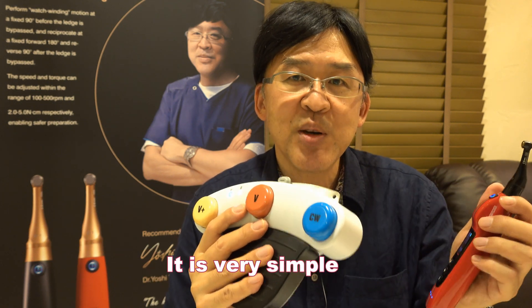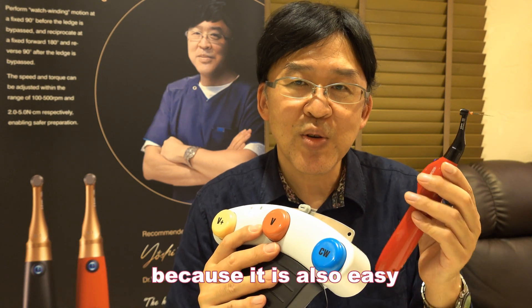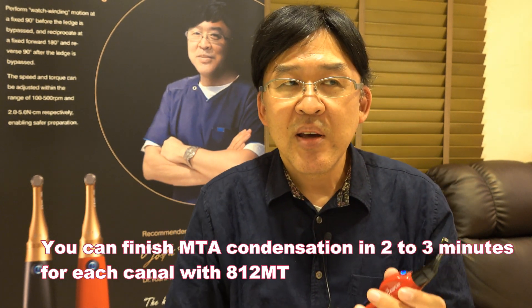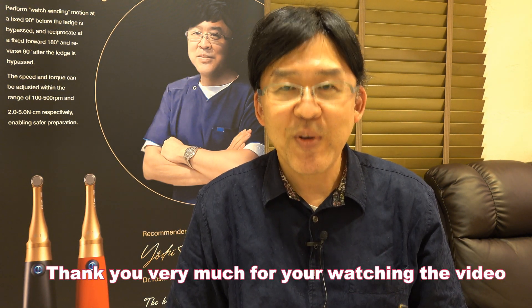Then you can finish the condensation with a plugger. It's very simple — you should use this to condense MTA. It's very easy. You can finish the MTA condensation in maybe two to three minutes with this device. Thank you very much.